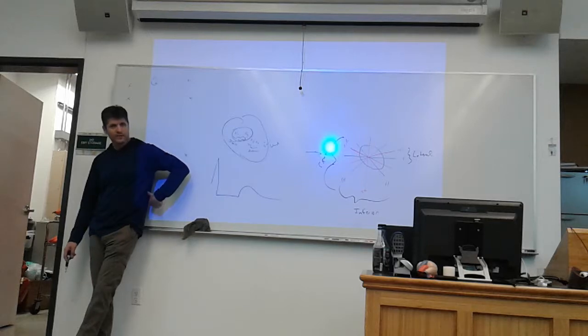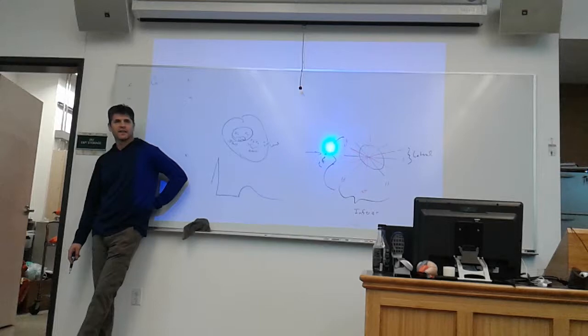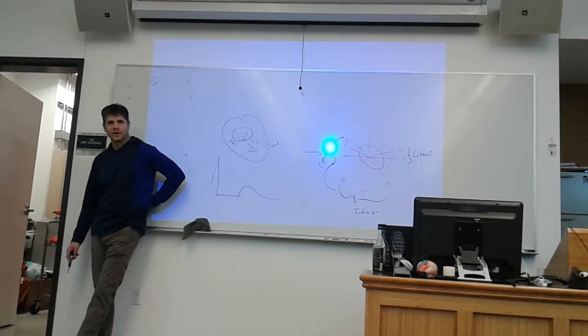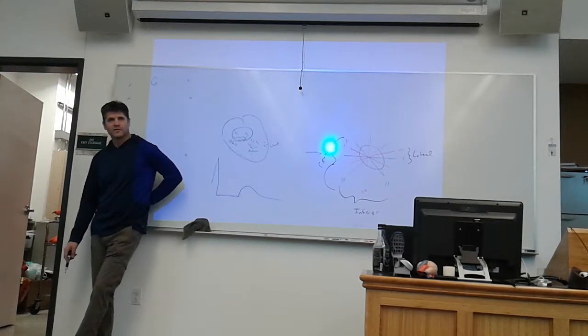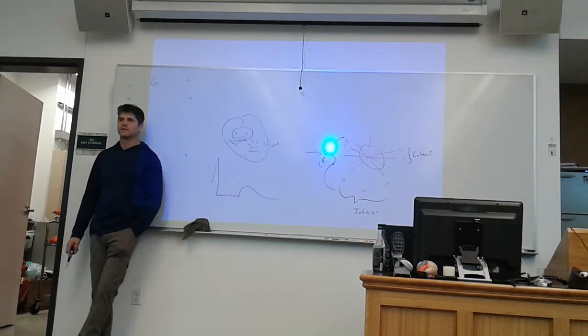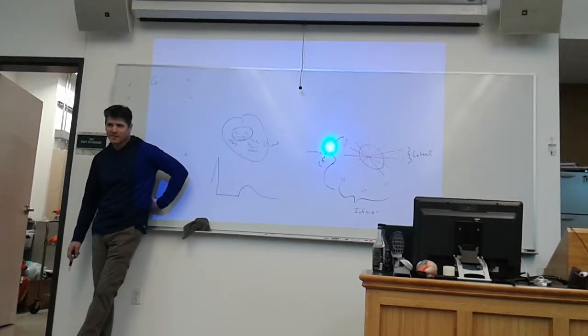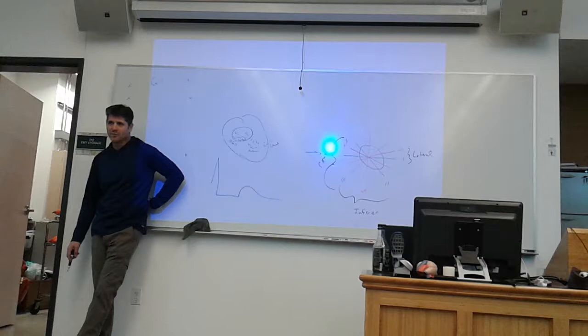V7 would be the posterior axillary line. Then V8 would be kind of center-ish on that, in the fifth rib space. V9 would be basically close to the spine. V10 would be almost on the spine. But 7, 8, and 9 is all we need. V7 would be the anterior lead, V8 would be in the middle.